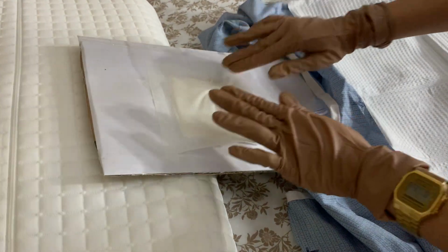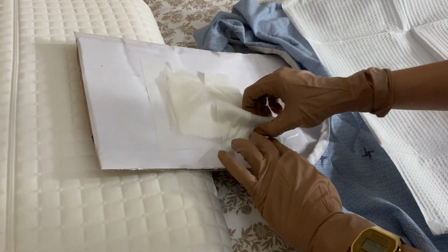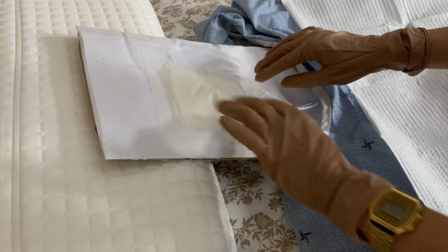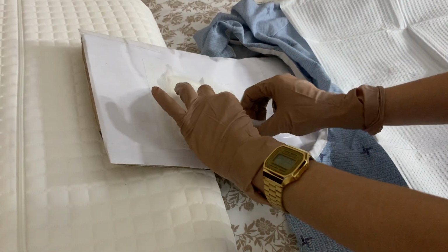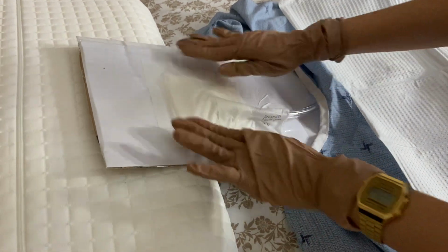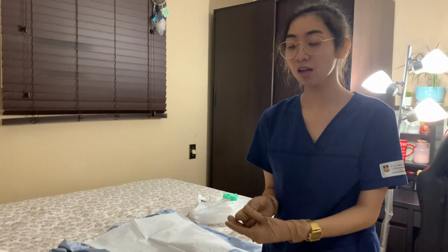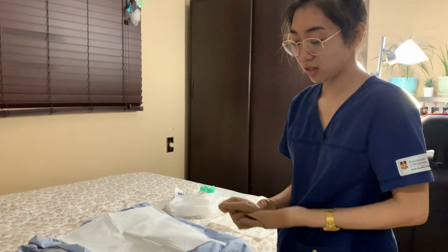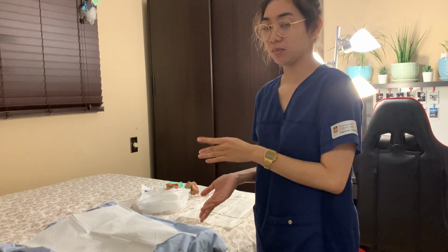And when I do this part, I'm just going to make sure that I tent under here to make sure that my chest tube stays intact and that it doesn't get pulled. Okay, now that's done, I'm ready to clean my bedside. And I'm just going to remove my gloves now. Again, do hand hygiene. So I'm going to make sure that I clean everything, and I'm also going to make sure that my patient's bed is in the lowest height.